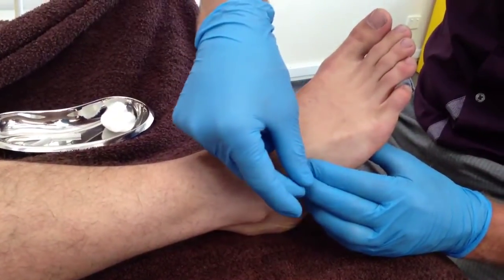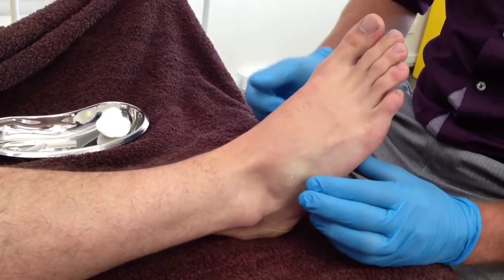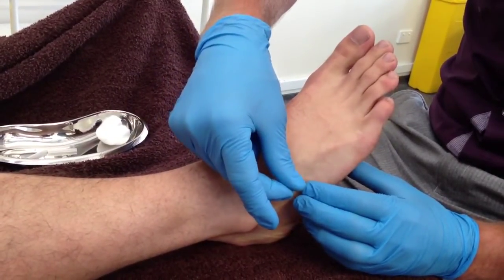The main precautions for this area, however, include the deep peroneal nerve and the dorsal vessels of the foot that run just medial to the extensor hallucis brevis muscle. Medial angulation when needling this muscle should be avoided.